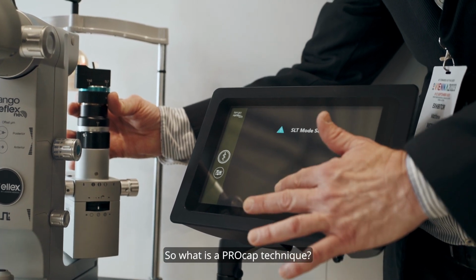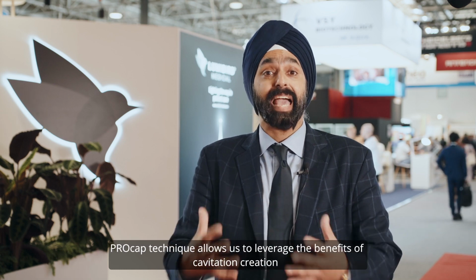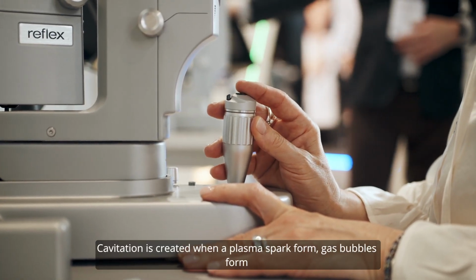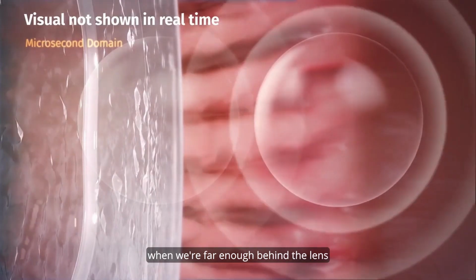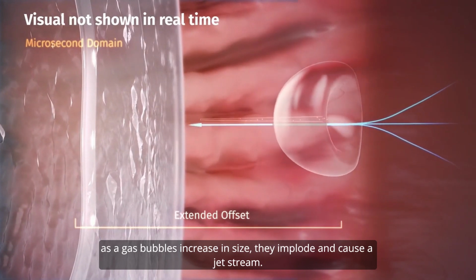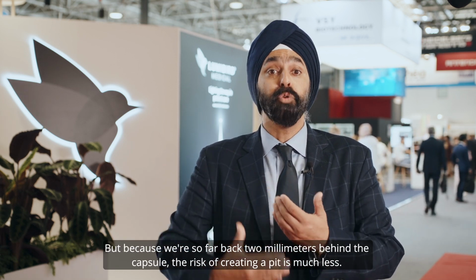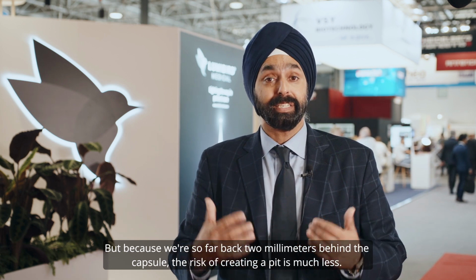So what is a PROcap technique? The PROcap technique allows us to leverage the benefits of cavitation creation, utilizing a 2 millimeter posterior offset. Now, why is that important? Cavitation is created when a plasma spark forms, gas bubbles form. When we're far enough behind the lens, as the gas bubbles increase in size, they implode and cause a jet stream. That jet stream has properties that can allow us to also break that capsule. But because we're so far back, 2 millimeters behind the capsule, the risk of creating a pit is much less.